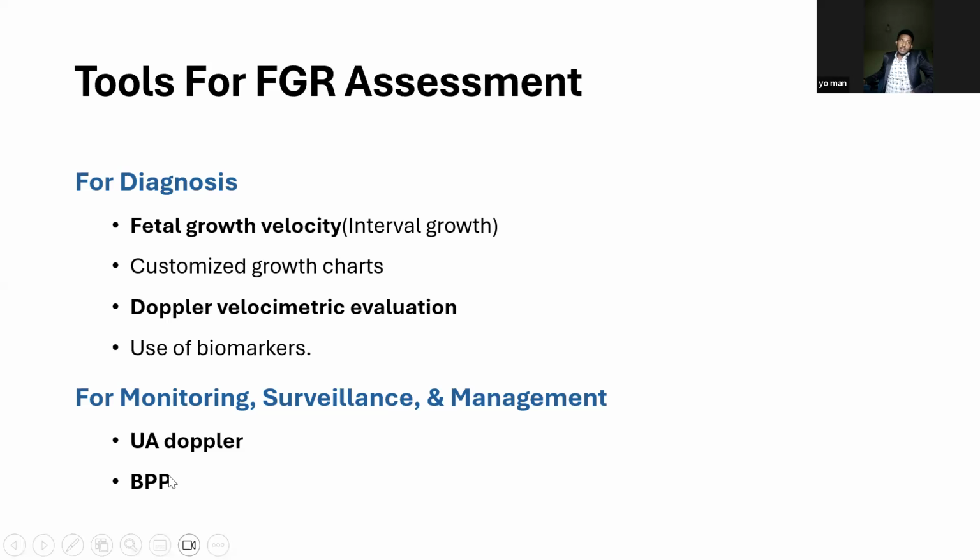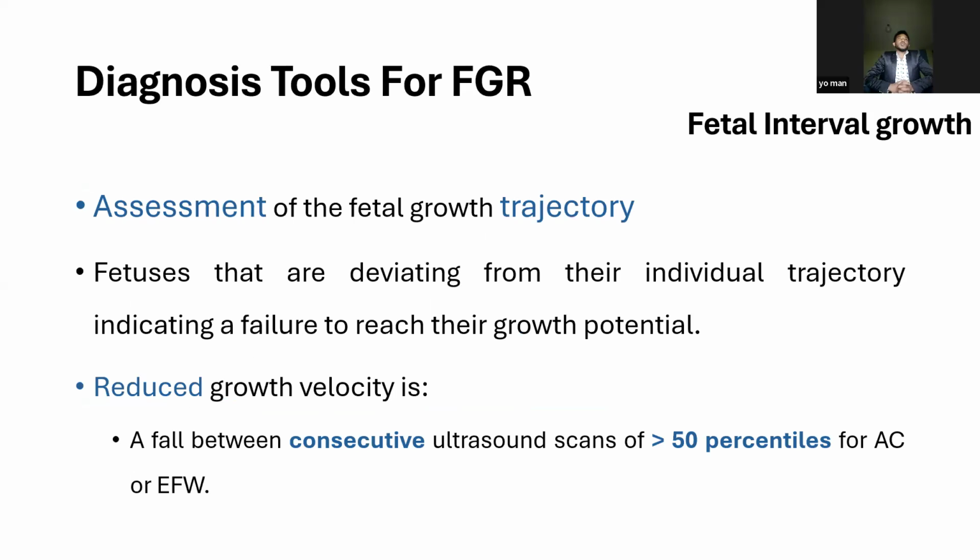Biophysical profile is not a diagnostic tool for FGR patients, and you should also know that.